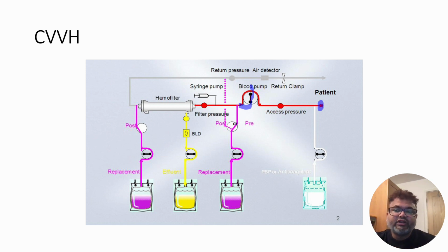So the dilution will be less in case of post-filter, because it will dilute whole blood inside the body. So the filter will get still concentrated blood. So you have to remember, if it will get concentrated blood, there will be more risk of clotting.